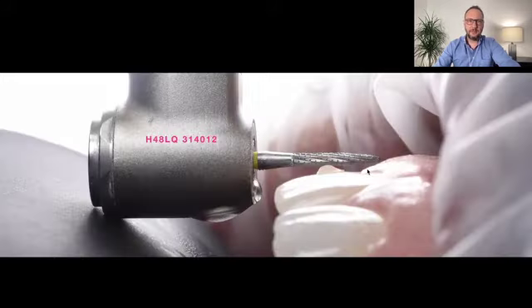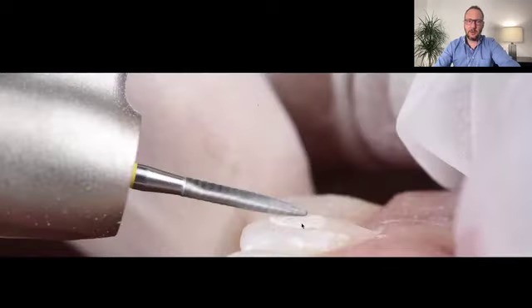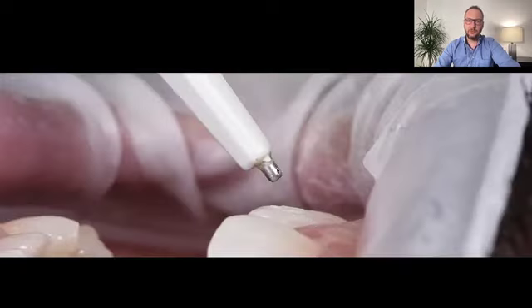So in the first stage, this burr is to remove the big excess, the bigger part, so it's faster. This is more aggressive, and then you can remove almost until getting to the enamel. And when you think you're going to get to the enamel, it's time for you to use a probe. You know that, but not a very thin and pointed probe, a more rounded probe, so you can create risks in the composite to help you.